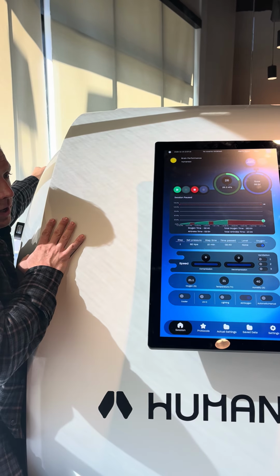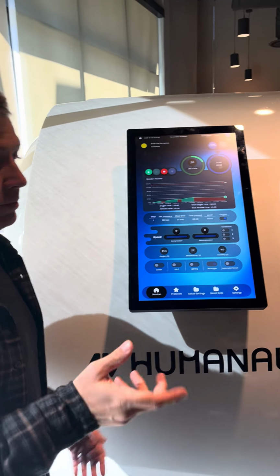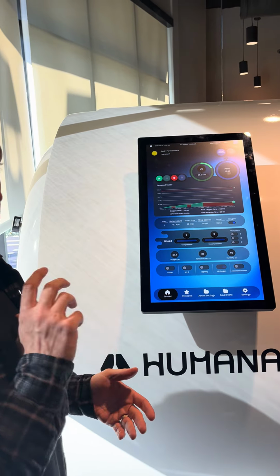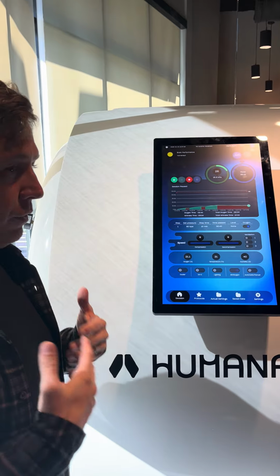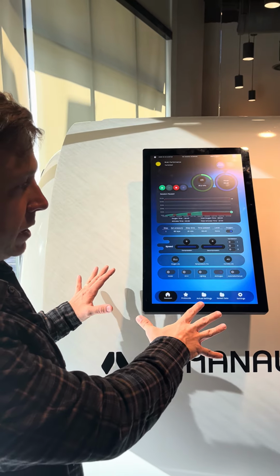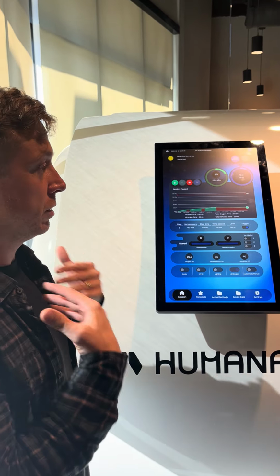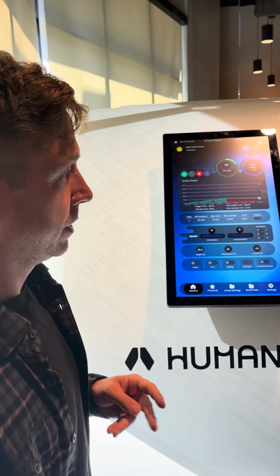Okay, you can have a plastic bottle of water in there, and sipping water can help. Try to keep gum and food out of the chamber because you don't have hands on. So if they were to choke on whatever's in their mouth, then you couldn't get to them right away.